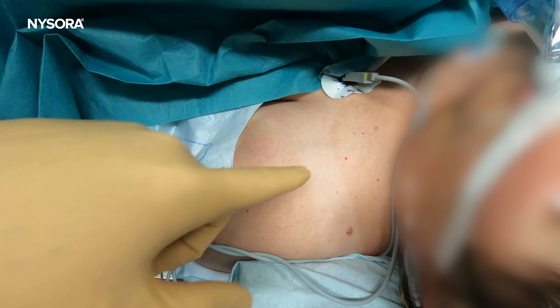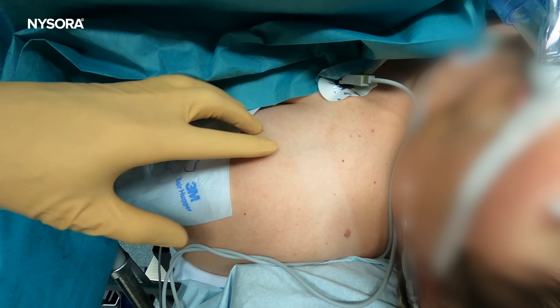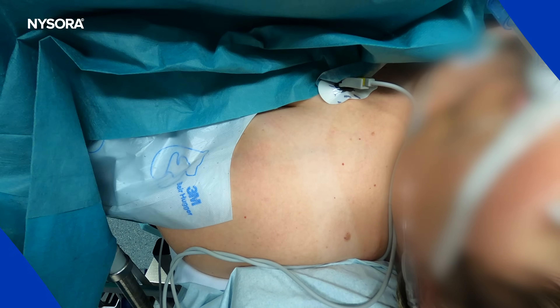Welcome to Nasero's YouTube channel. In this video, we are tackling a critical scenario that anesthesiologists and ED healthcare workers often face: securing an emergency IV access in a challenging patient where timing is of essence for patient safety.